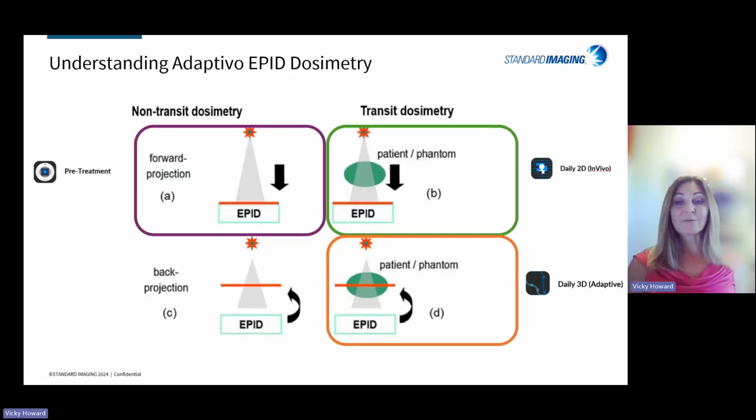So now that I've really hammered out the whys of Adaptivo EPID dosimetry, I'm going to take a moment to give a quick overview of the hows. If you tuned into Shannon Holmes' TG307 overview webinar 2 weeks ago that I also participated in, you'll likely recognize this slide. At the time, we didn't go over too much the details of Adaptivo in relation to this, so I'm going to dive a little deeper into that today.